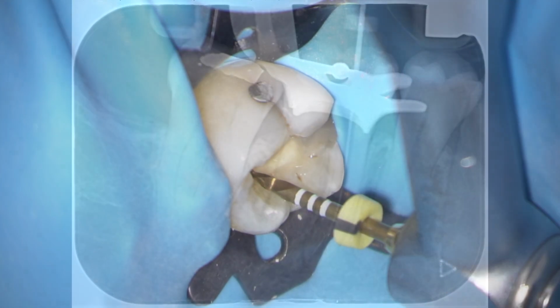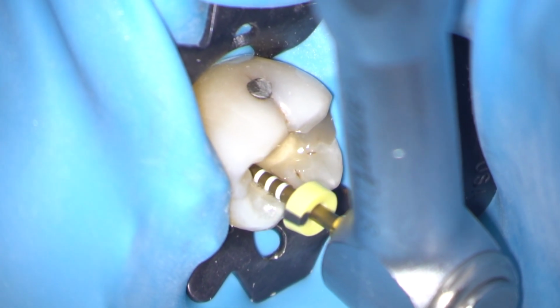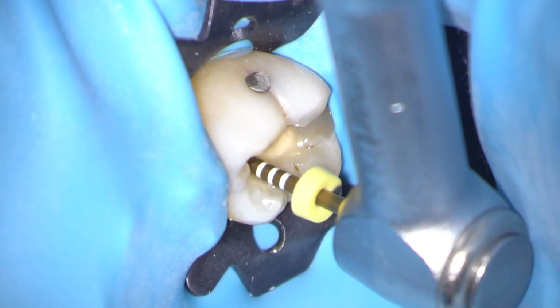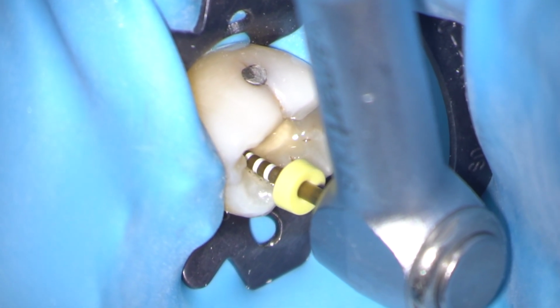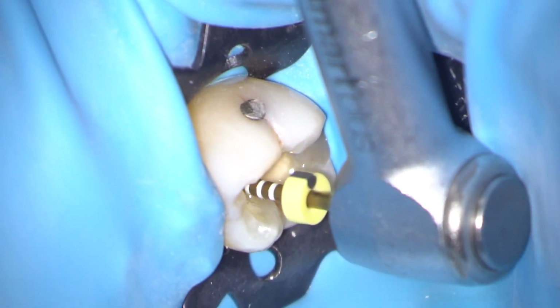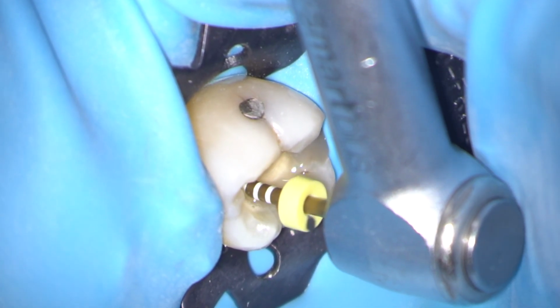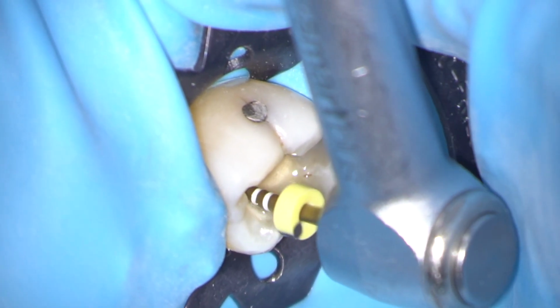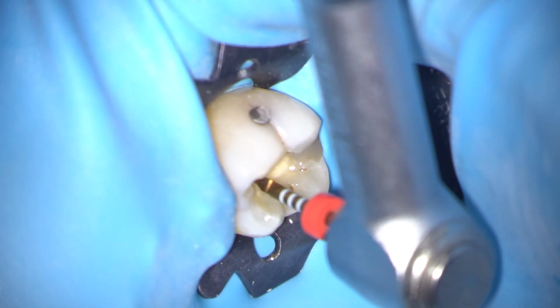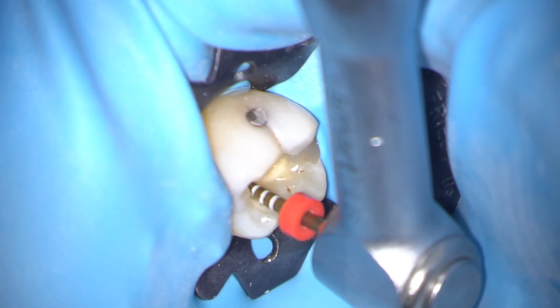When you're trying to remove instruments from curved canals, you will create a little ledge on the outer curve, and you have to do this in order to get your instrument lateral to the piece of fractured instrument. So now you can see me preparing the mesiolingual canal, and I'm using a brushing technique to try and even out some of the ledge. A Wave.One Gold primary instrument is used to complete preparation.